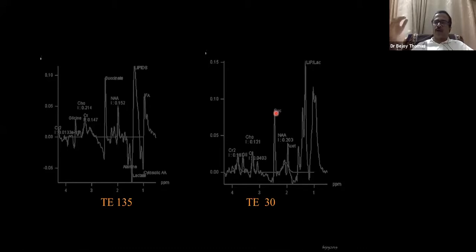So they are not coming up to enough concentration to be detected by MR spectroscopy. In addition to the cytosolic amino acids, when you see succinate and acetate, usually in a pyogenic abscess acetate is a larger peak than succinate. In this particular case, it is the reverse.